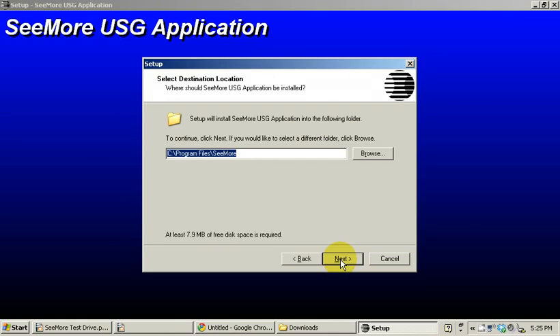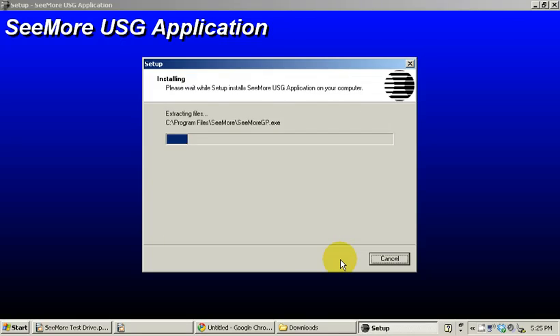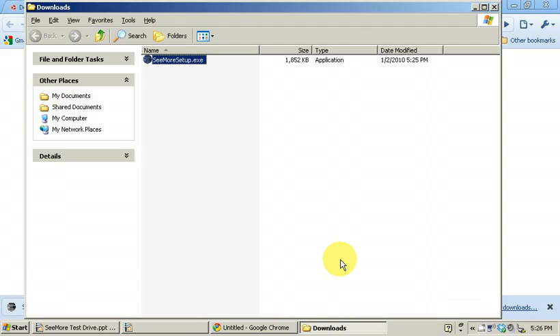Just click on next and everything's fairly automatic, and just use the defaults. Click on install and it will install on your desktop, and this takes under a minute. It's very quick. When it's through installing, just click on finish, and that's all there is to it.